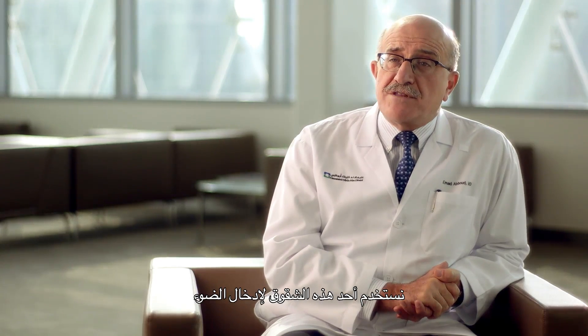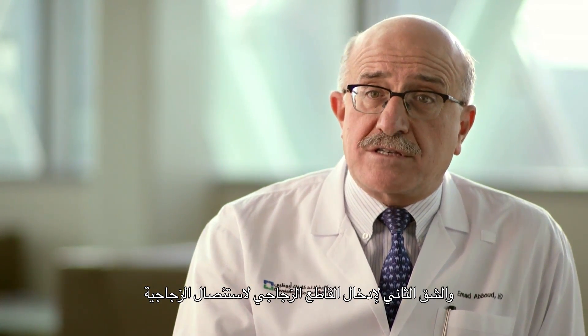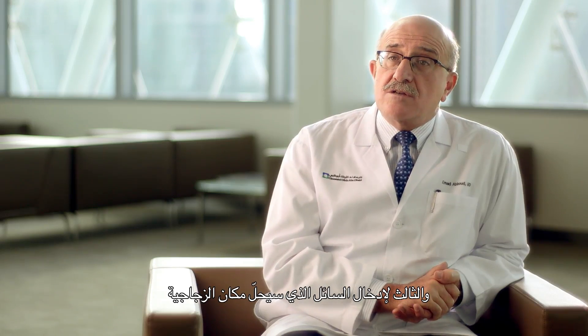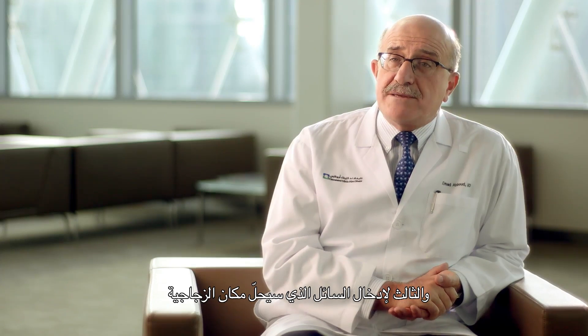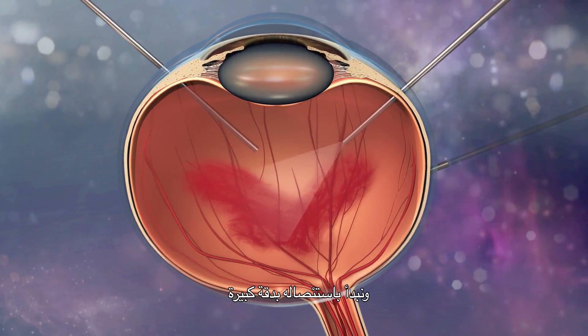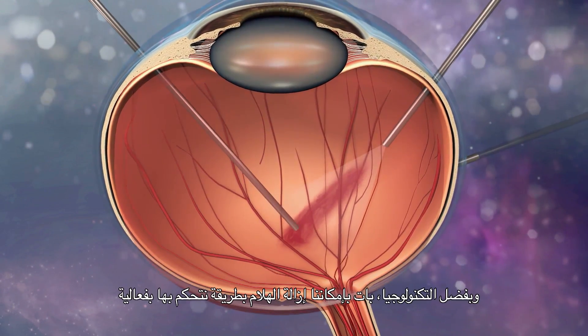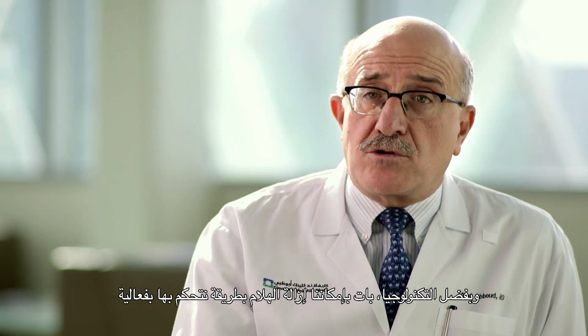We use one incision to introduce light, another to introduce the vitreous cutter that will remove the vitreous, and the third to bring in the fluid that will replace the vitreous. We introduce the vitreous cutter inside the vitreous gel and, in a very controlled manner, start removing it. The rate of removal is very controlled.